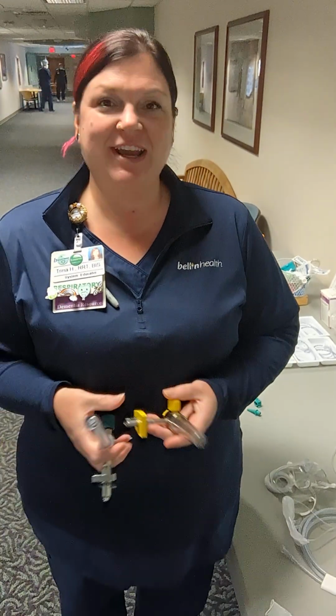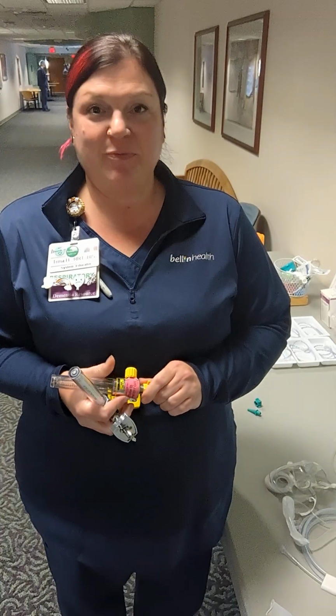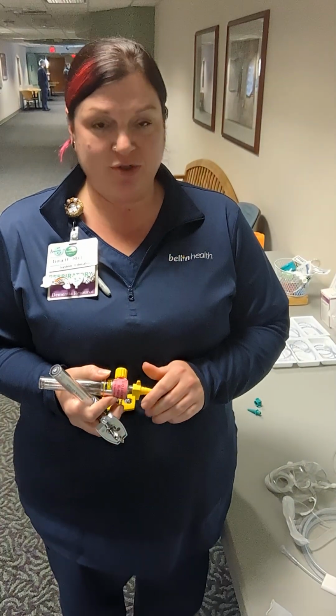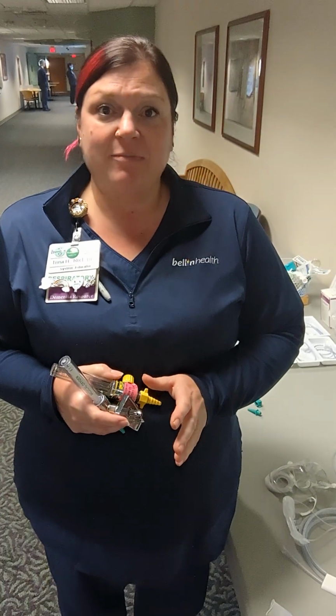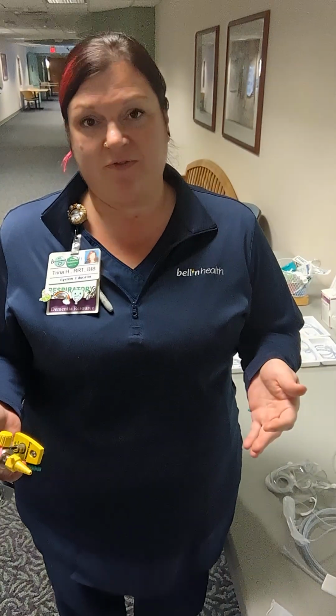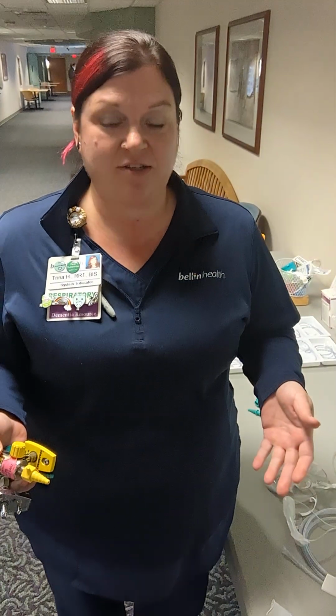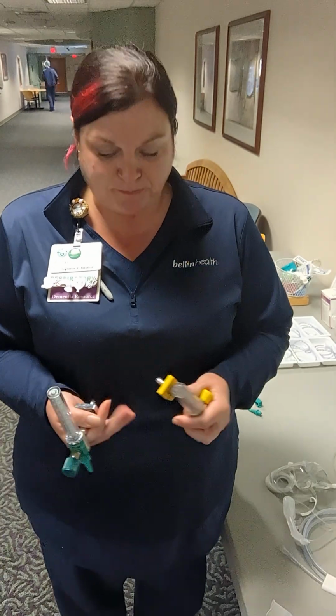I'm from Respiratory, and today we're going to talk about respiratory care and how it pertains to nursing. So first we're going to start with FiO2 and flow. FiO2 is something that we use all the time when we're talking about oxygen and devices, but we don't always quantify it in those terms. We don't say FiO2 of 25%, we say 1 liter of oxygen. And so I'd like to clarify what those terms mean.